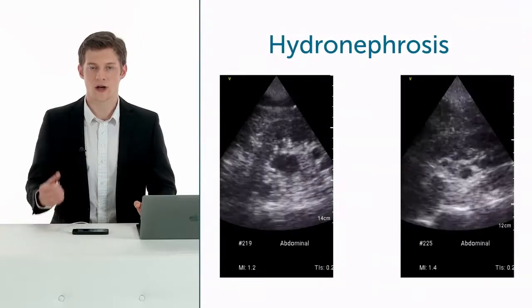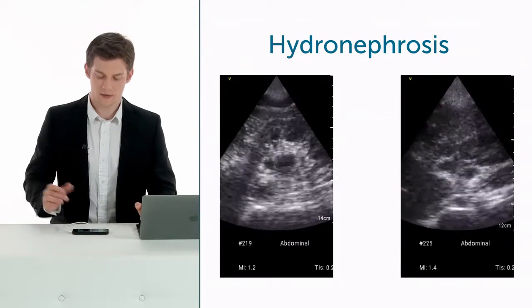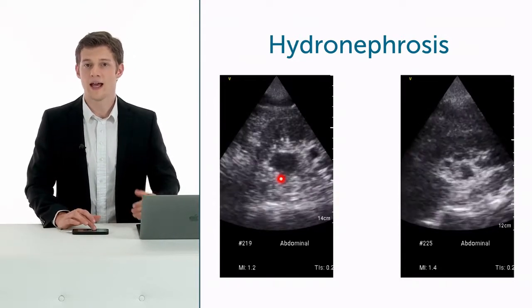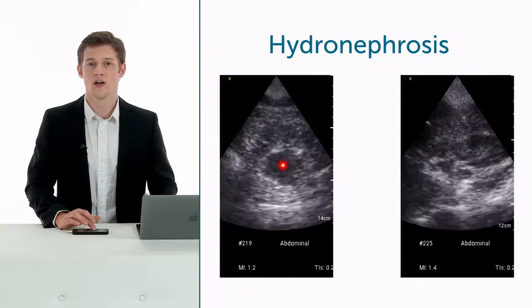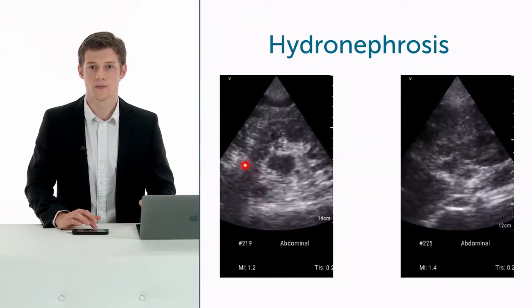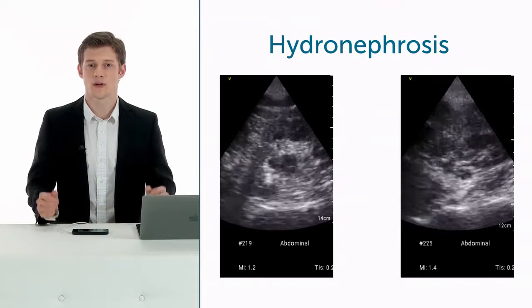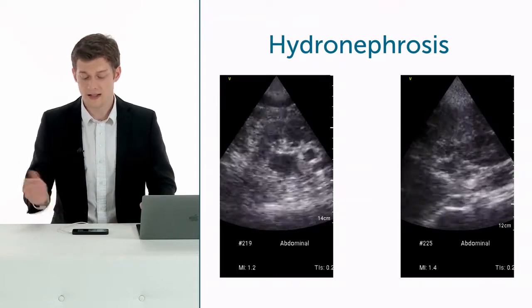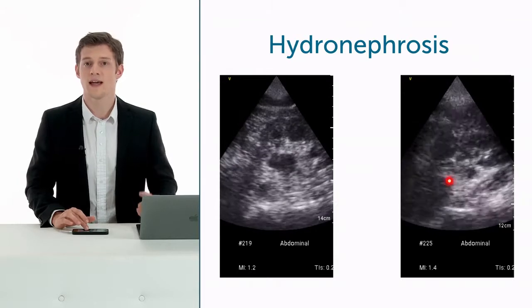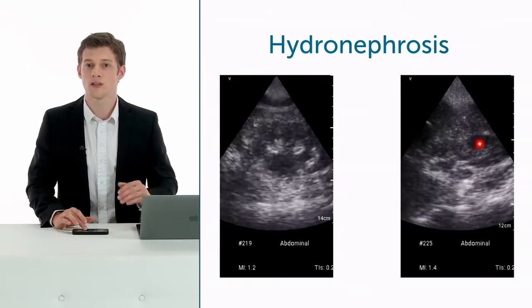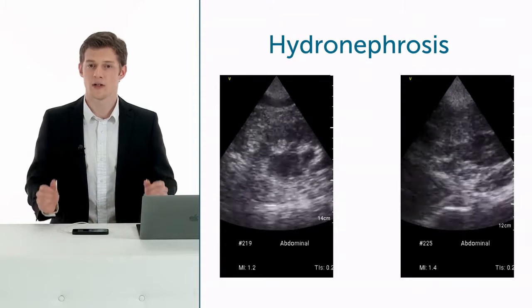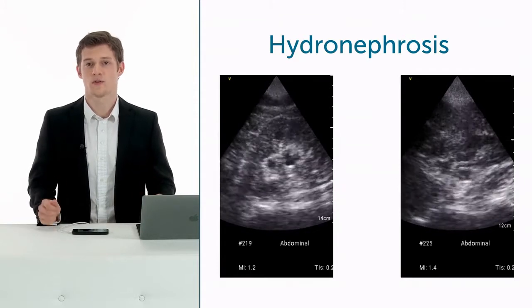Two more cases of hydronephrosis for you. On the left hand side, you see a dilatation of the renal pelvis and the dilatation of the renal calyces with a narrowing of the renal parenchyma. This is a clear case of grade 3 hydronephrosis. On the right hand side, you see a dilatation of the renal pelvis and the renal calyces too, but no narrowing of the renal parenchyma at all — a very clear case of grade 2 hydronephrosis.